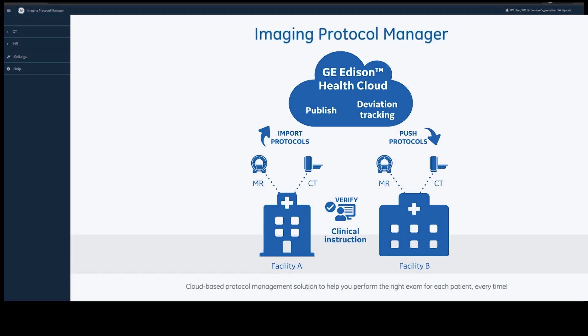Imaging Protocol Manager, or IPM for short, is a cloud-based tool that can connect your CT or MR devices and can help you import, manage, and send your standard protocols back to those devices.